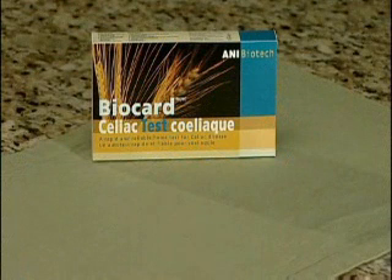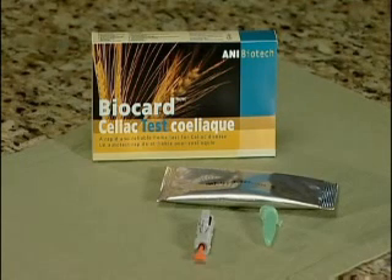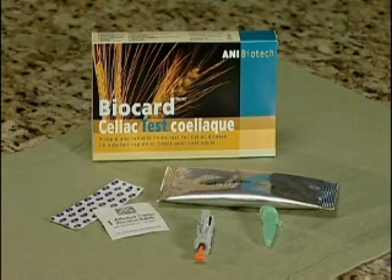Before taking the blood sample, prepare all the test components: one aluminum pouch with BioCard test strip and plastic filter tip, one sterile automatic lancet, one colored plastic vessel with glass capillary tube, one alcohol swab, one bandage, and one clear vial with 0.5 milliliter sample dilution buffer.